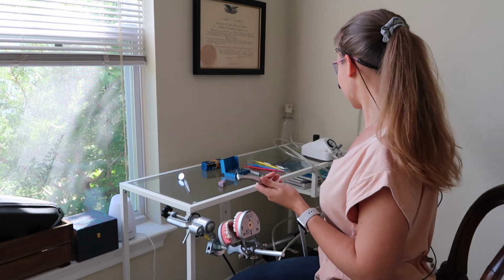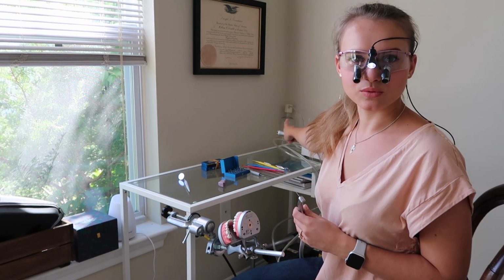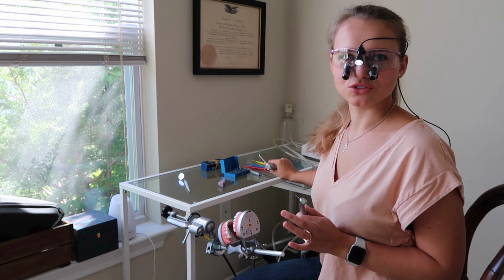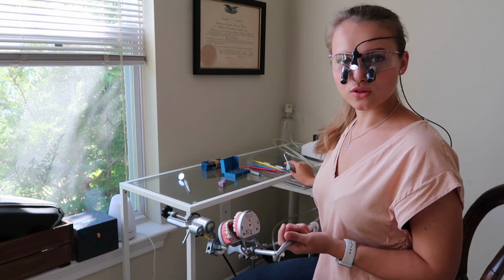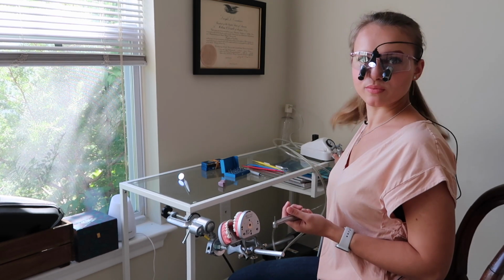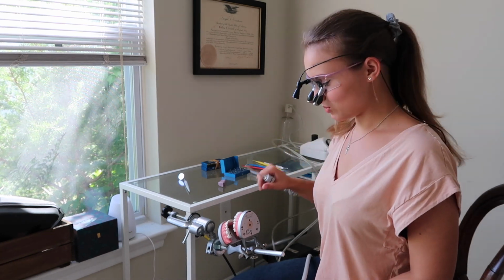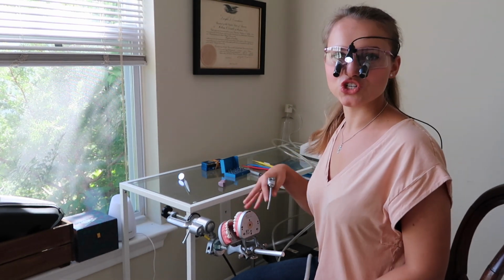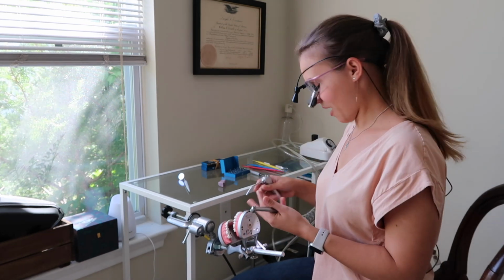Anyway, so now there's also a water attachment. There's a bottle over here in the background. You can probably see it. I have it just stuffed away. You cannot disconnect it, so it's kind of bulky and just drags everything away. So you can fill that bottle with water. There's a switch over here on the unit, which is a bottle switch. But I would not recommend using water with this, because that would be really messy if you just spray water all over here, because there are no cheeks, no container to contain water in your prep.